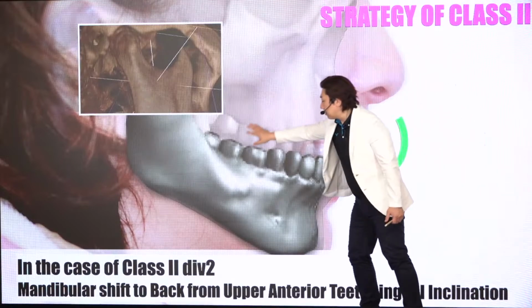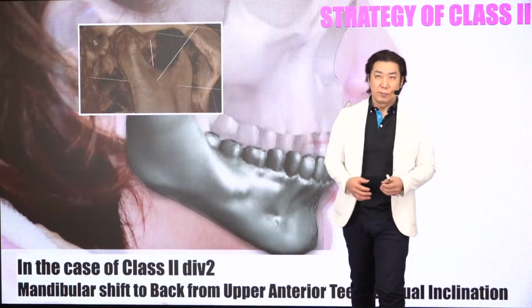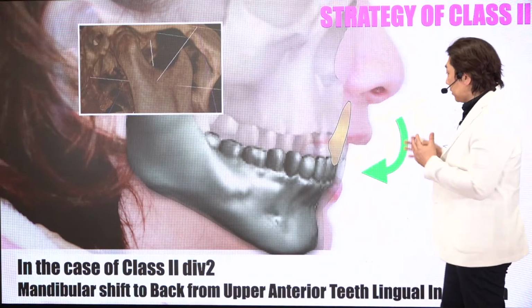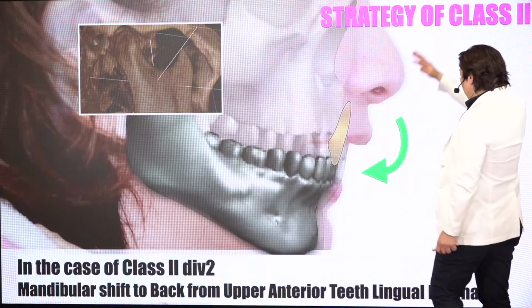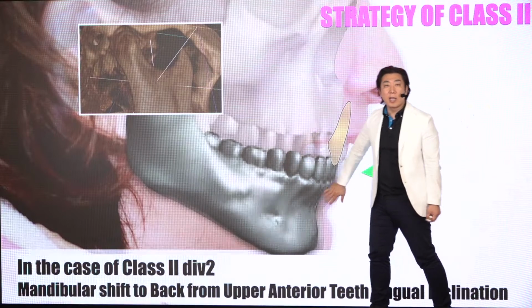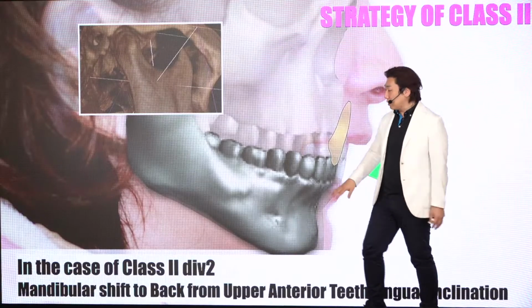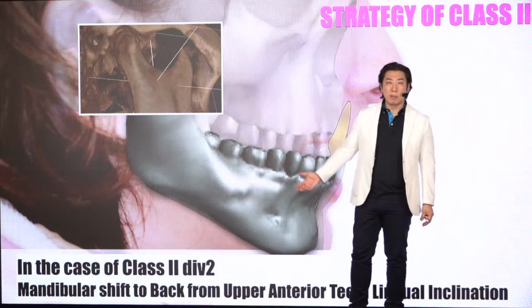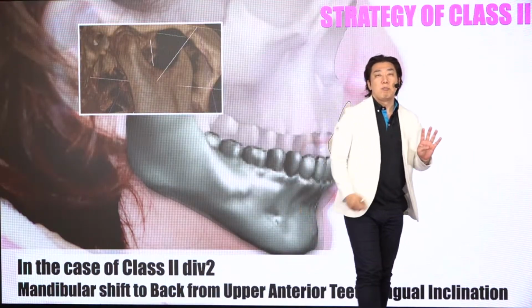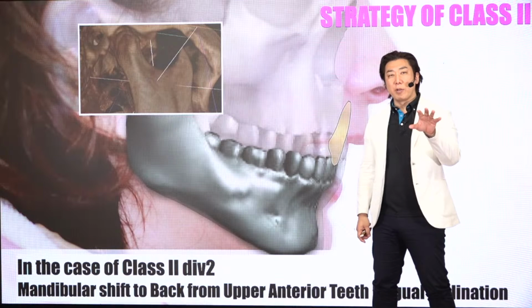If we take a scan of this situation and send it to Align Technology, is this the right way or not? My opinion is no. My opinion is we have to check first, initially, where the problem is for this patient. Of course, anterior guidance for the occlusion is a problem, but a bigger problem is the position of the mandible, the position of the condyle, right? The condyle position and mandibular position cannot be understood in the Invisalign ClinCheck simulation.